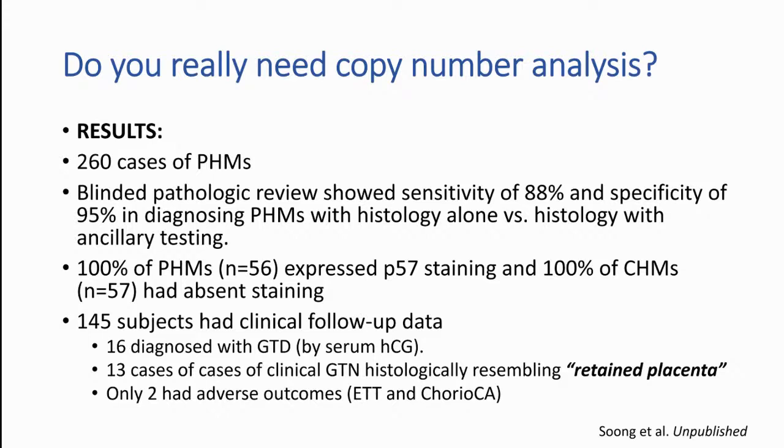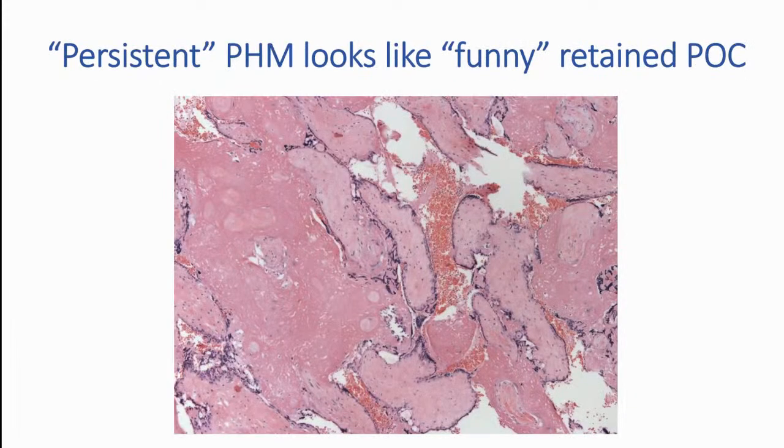Here's what the persistent partial mole looks like. The villi are often funny-looking and still retain their odd shapes and large size, but they're very sclerotic, and because of that, it may escape your notice.